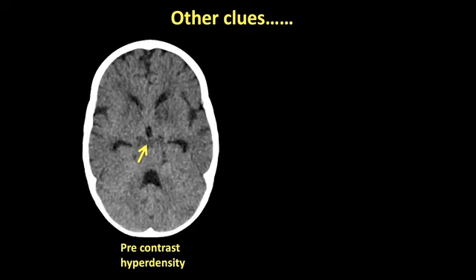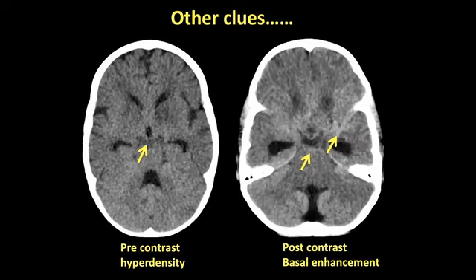What does that mean? Well, if you have a patient who's got a decreased level of consciousness and has this, you need to start wondering, particularly if they are malnourished, immunocompromised, or come from a developing country, whether the infection they have might be tuberculous meningitis. And then look very specifically for contrast enhancement in the basal cisterns and in the MCA cisterns.